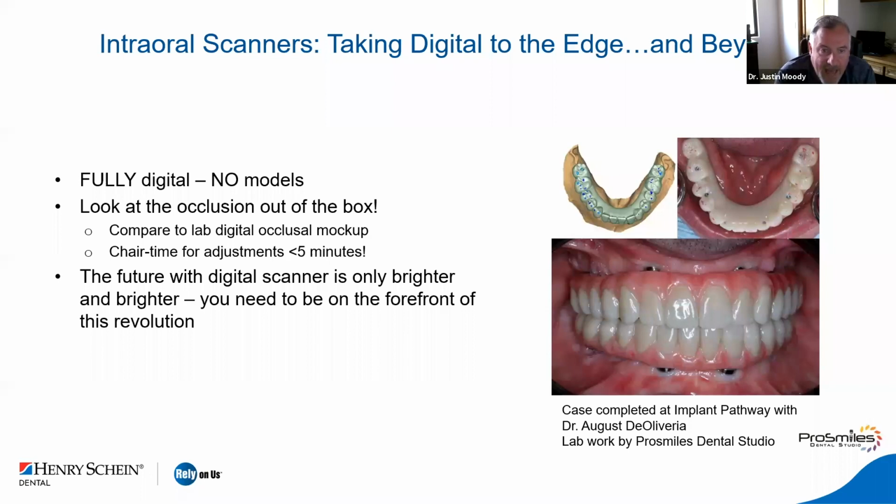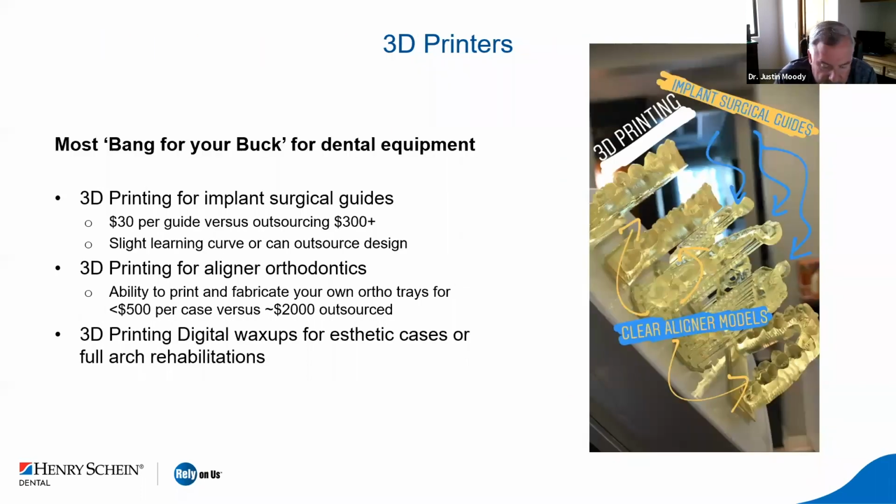One of the things today, so for me, it was digital radiography, on the PA side. And then it was cone beam CT, which we're going to talk about here in a little bit. And then today, the hot topic right now is 3D printing. And 3D printers come in a variety of shapes and sizes, and they come in a variety of price ranges. And this is something that so many of you can have in your practice right away.